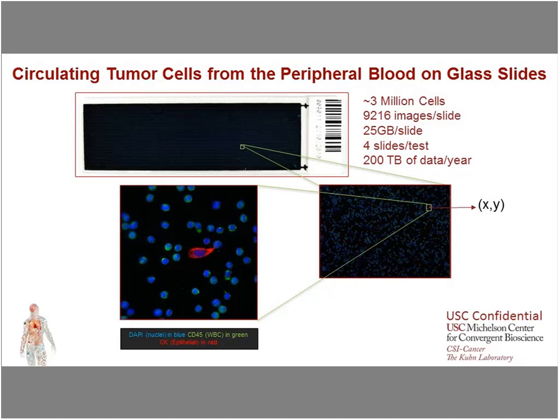Images were taken with an automated fluorescent microscope, and CTCs were classified as cells that are CK positive, CD45 negative, and demonstrate other distinct morphological characteristics, such as cell and nuclear size, NC ratio, and subcellular localizations.